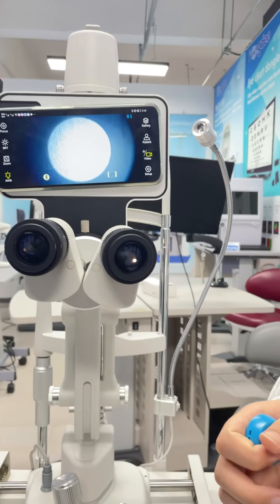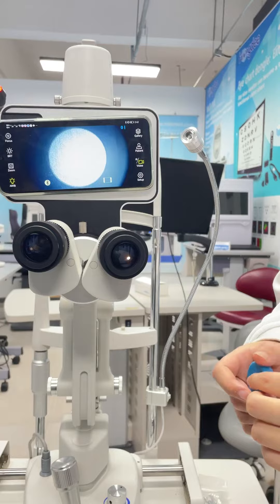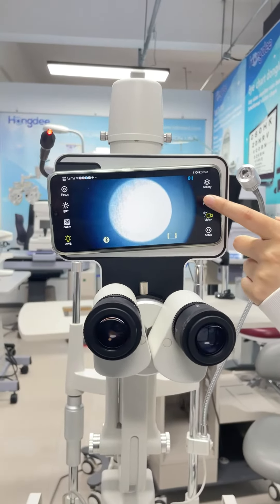Next, before we take a photo or video, we need to select the correct patient profile.